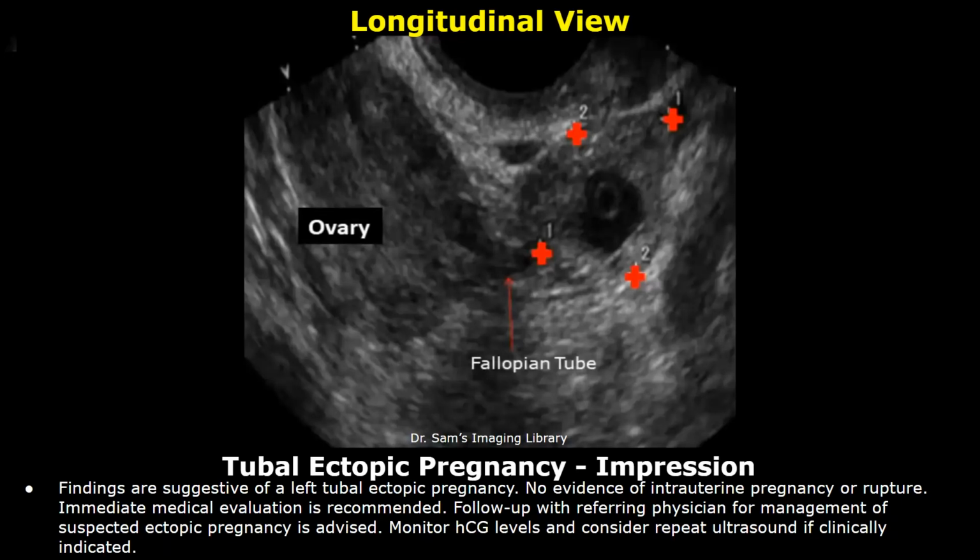No evidence of intrauterine pregnancy or rupture. Immediate medical evaluation is recommended. Follow-up with referring physician for management of suspected ectopic pregnancy is advised. Monitor HCG levels and consider repeat ultrasound if clinically indicated.